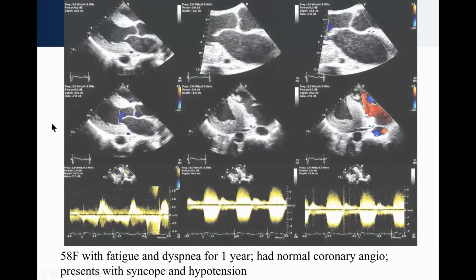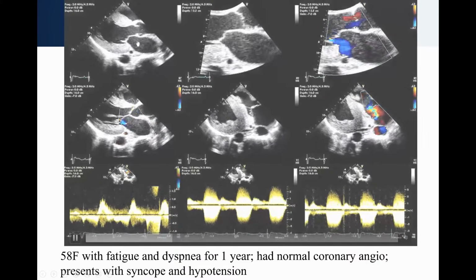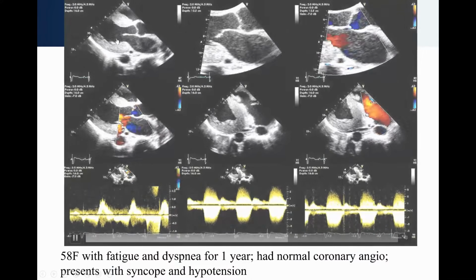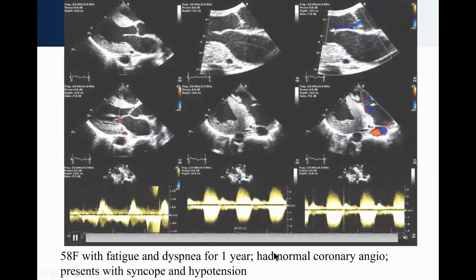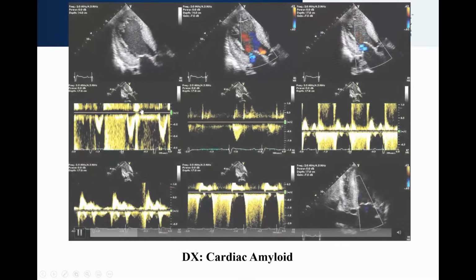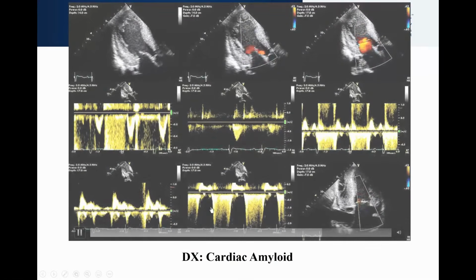This is a patient that is basically terminal. This is a terminal phase of amyloidosis where basically the heart barely moves. But notice it's still not dilated. So you don't get dilation when you get infiltration with amyloid. But this patient did not last much longer after this echo was done. Again, notice the very low velocity time integrals, indicating extremely poor cardiac output.